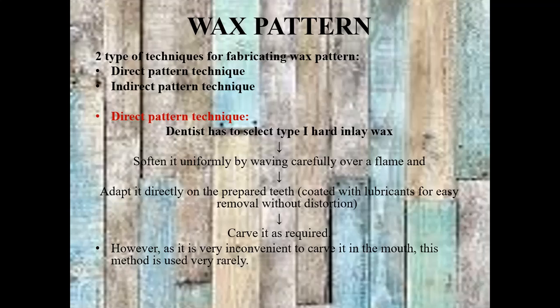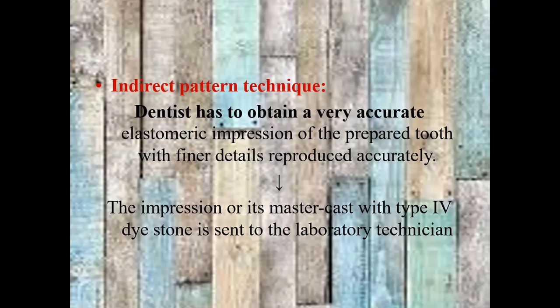Now, however, as it is very inconvenient to carve it within the mouth and it's a time consuming procedure, this method is now rarely used.